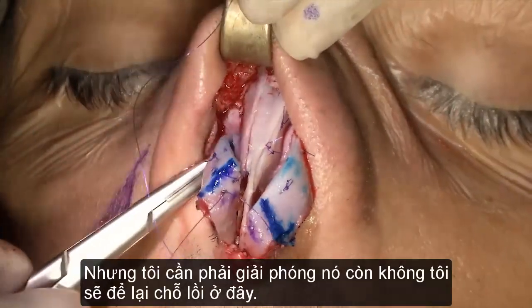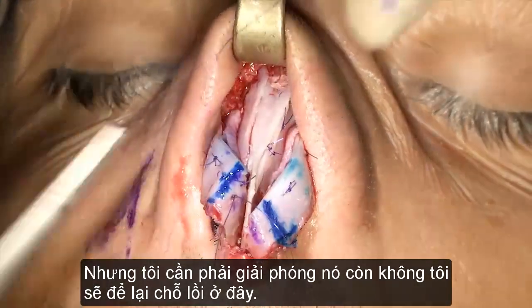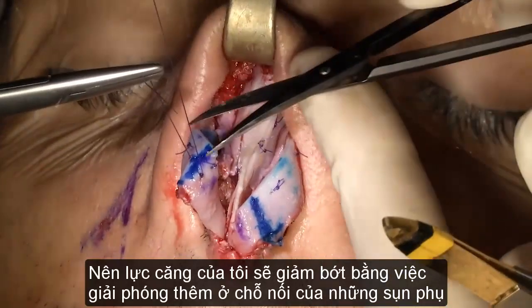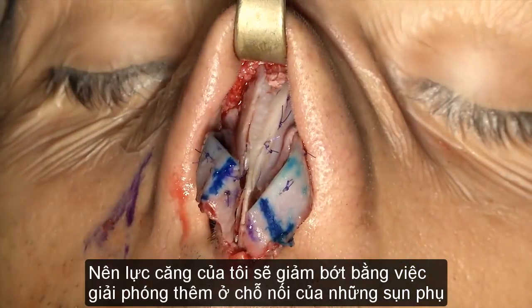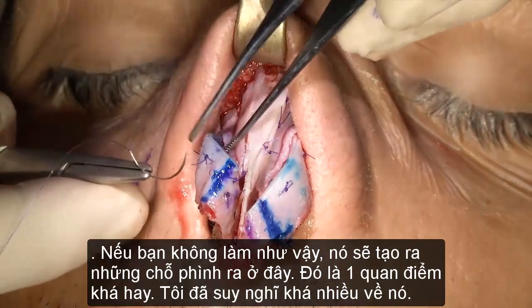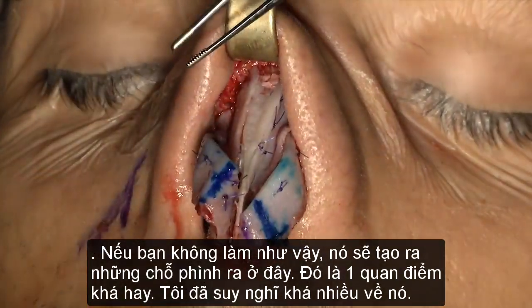But I need to release it, otherwise I will have another convexity here. So my tension is diminished by my releasing them at the junction of the accessories. If you don't do that, it will end up with a bulge here.